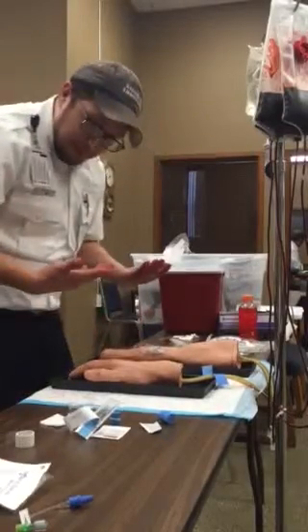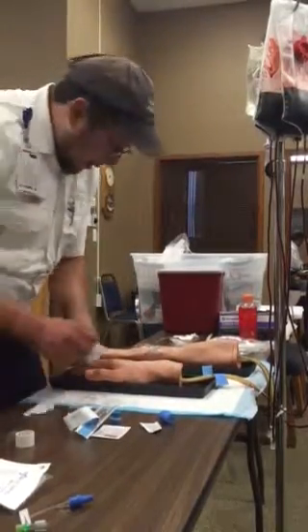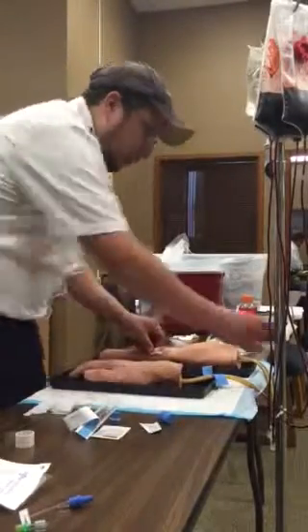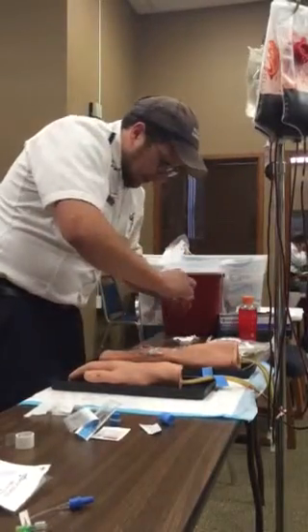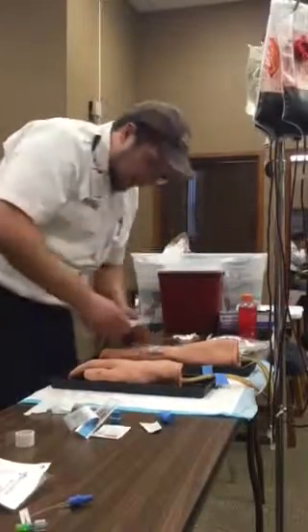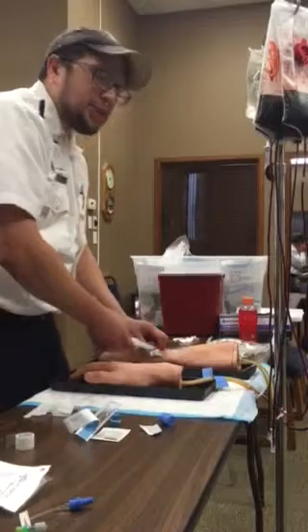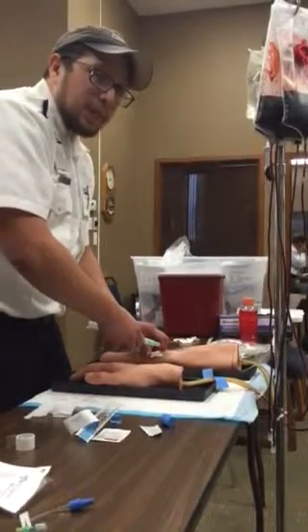I'm going to have my BSI on. I'm going to grab my alcohol wipe here and clean the port of my line. I'm going to go ahead and stop my flow, and I'm going to grab my syringe here. Make sure that's on there. I wiped my line, make sure it's clean, and I'm going to ask my patient to see if he's allergic to any medications. Your patient is not having any allergies. Okay.